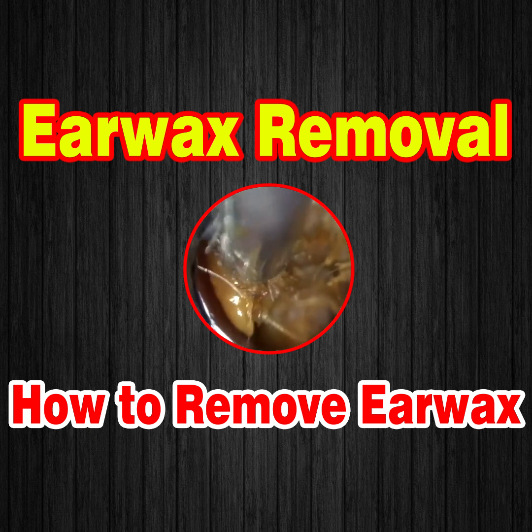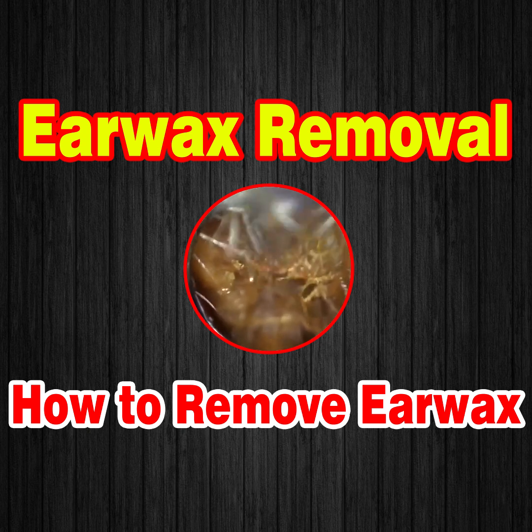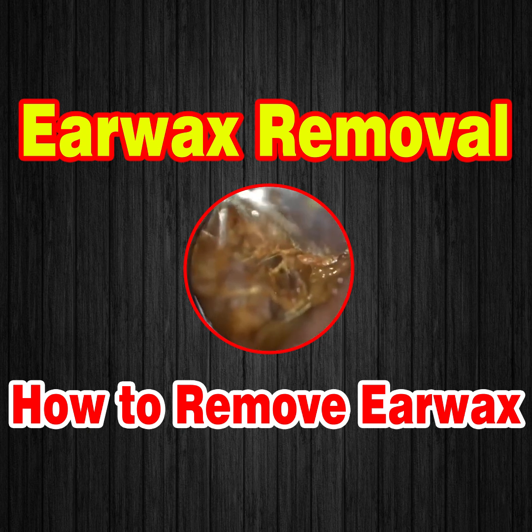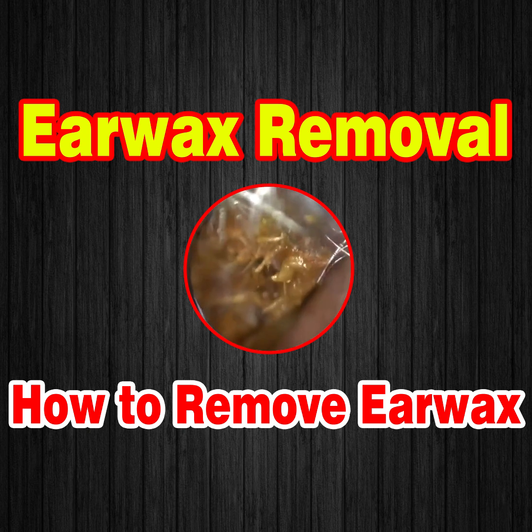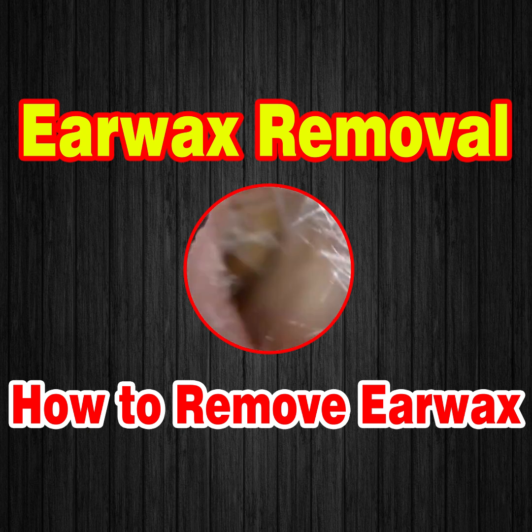And they had a case where it was a very narrow ear canal, and they spent about 20 minutes just chiseling the external part of the ear canal. So they use a microscope. It's a very high quality microscope, and you can compare the WAXscope similarly in terms of optics to a microscope.